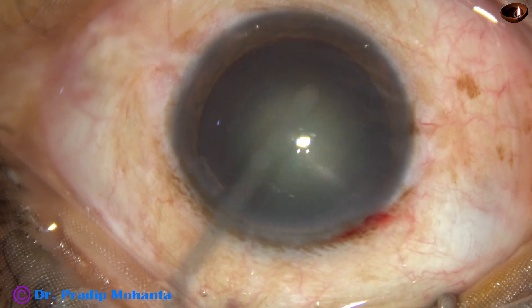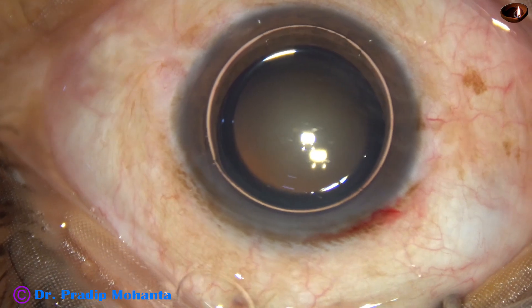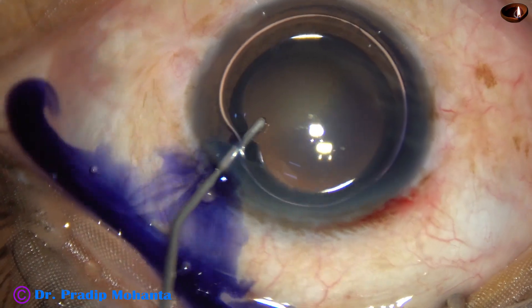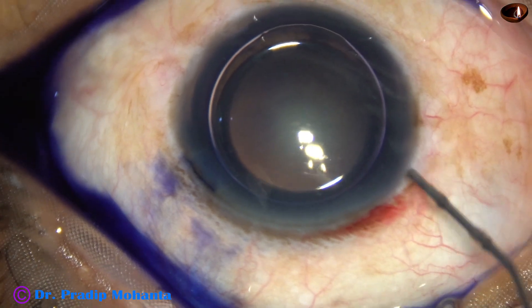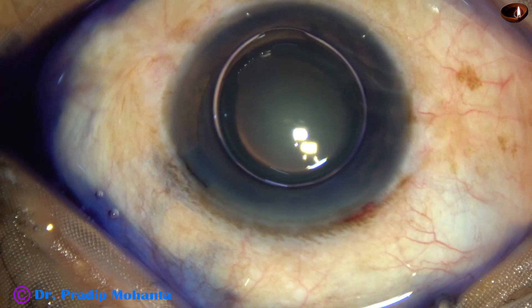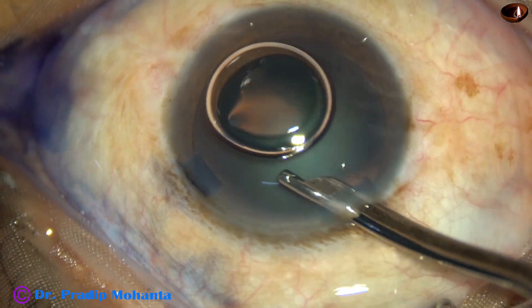An air bubble is injected to fill out the anterior chamber. Beneath this air bubble, trypan blue dye is applied over the anterior capsule. The dye should touch all parts of the capsule for uniform staining. The dye is then washed out.